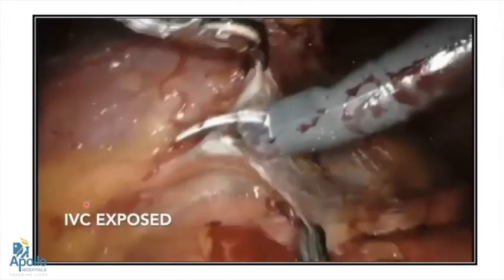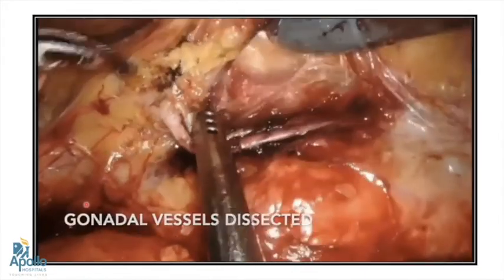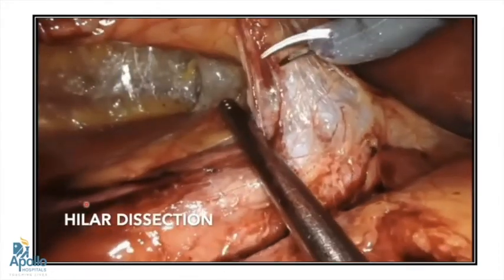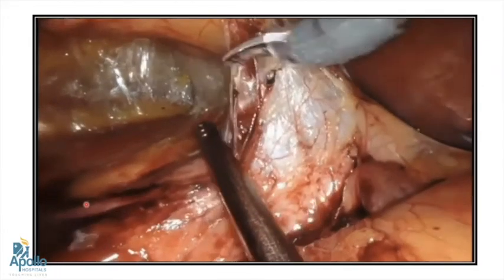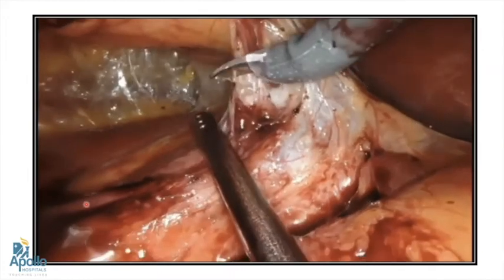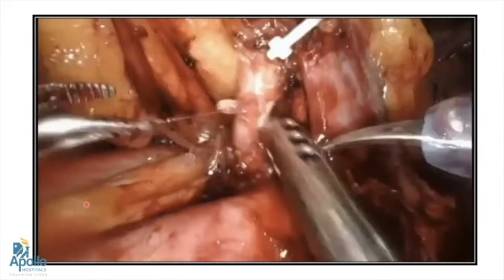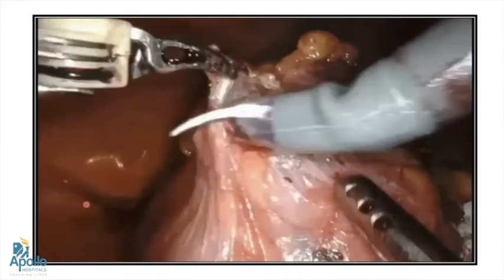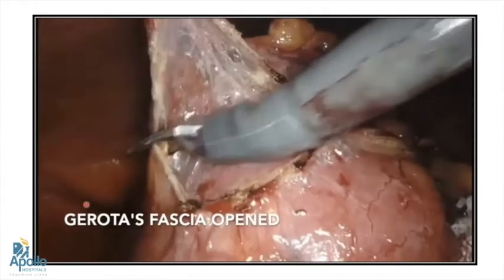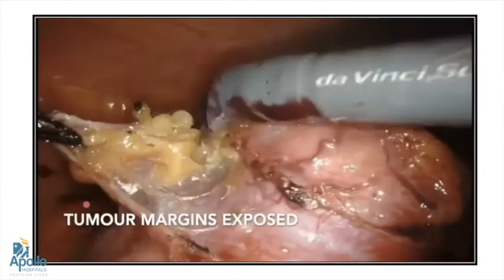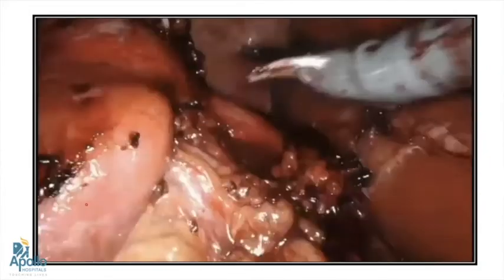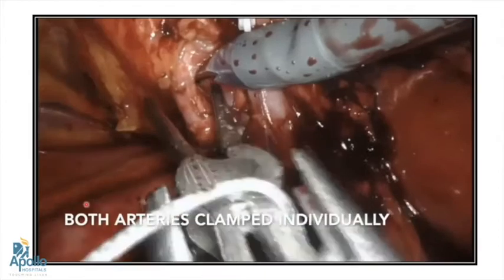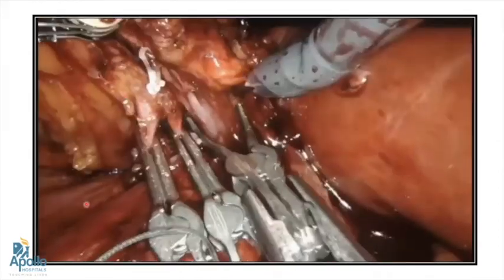Once the colon is mobilized, we lift the lower pole fat to identify the ureter. On the right side, it is important to drop the gonadal vessels to prevent inadvertent traction. The hilar vessels are then dissected individually — both artery and vein — and we should always look for an accessory artery. The tumor is demarcated by opening Gerota's fascia all around, maintaining 1–2 cm of normal parenchymal margin. Since this tumor lies close to the sinus fat, the sinus fat is also dissected well.